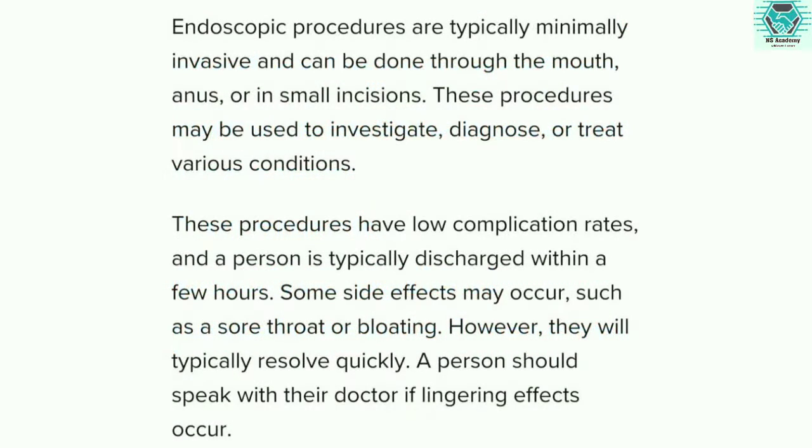Now, why do I need an endoscopy? What is the answer? Endoscopy allows the doctor to visually examine the organ without having to make a large incision. A screen in the operating room lets the doctor see exactly what the endoscope sees.